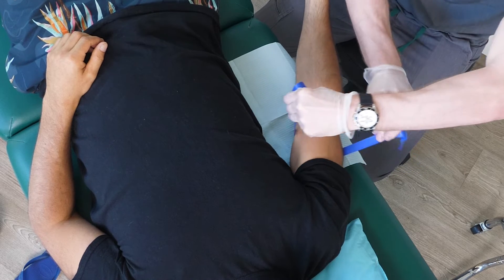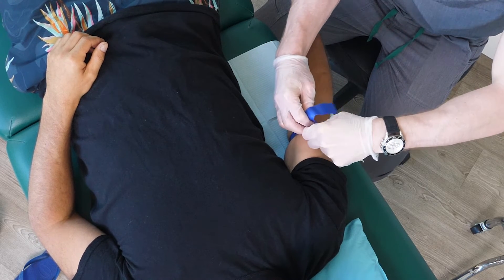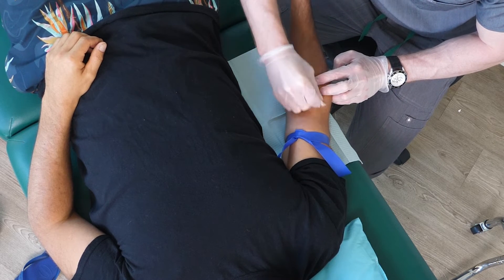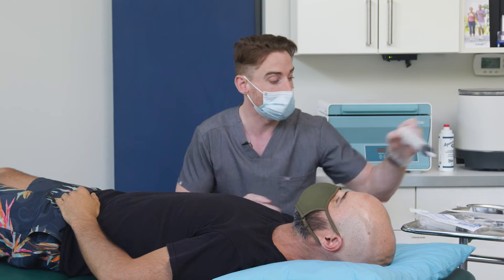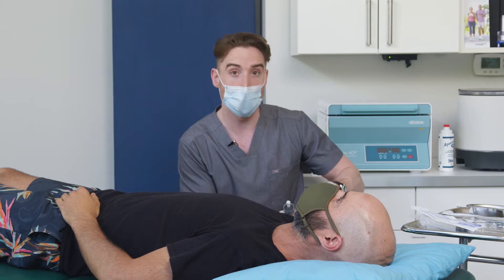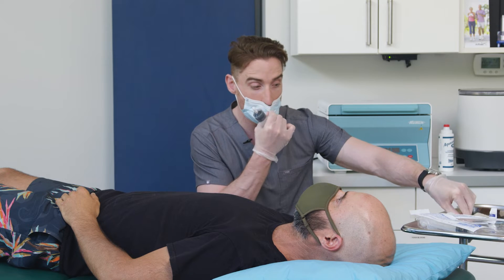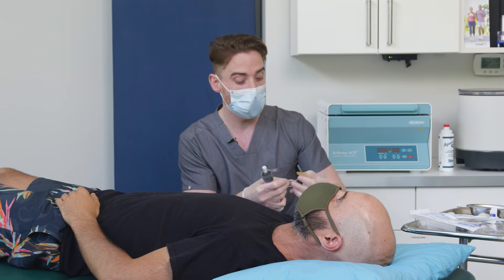We're going to be using a tourniquet to help make the veins a little more pronounced for drawing the PRP. We're going to be wiping with alcohol, making sure that we're as clean as can be. Today we're going to be using the Arthrex PRP system — the Angel system by Arthrex — and that system will be collecting 120 ml of whole blood. That will be centrifuged down to approximately three to four cc's of concentrated PRP. Processing time can take upwards of 20 to 30 minutes.